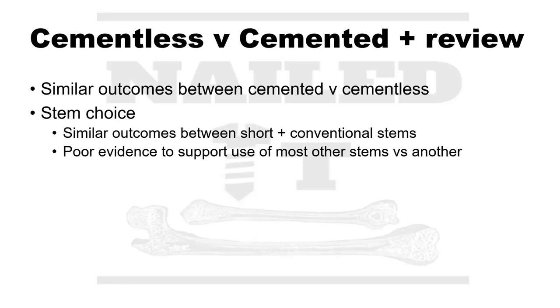Yeah, so this is a controversial thing. And if you ask different people, you'll get different answers, right? Okay. So this is just me speaking for me. So first of all, going back to your point about similar outcomes between cemented versus cementless, maybe over the long term or from a bird's eye view, but if you subdivide it into different groups, you find different answers. So there's literature that shows in the setting of geriatric femoral neck fractures that there is decreased rate of intraoperative and periprosthetic fractures when you use cement versus press fit. So that's one population. And then there's other studies looking at elderly female patients or people with osteoporosis who seem to benefit more from cemented because of the decreased fracture risk.